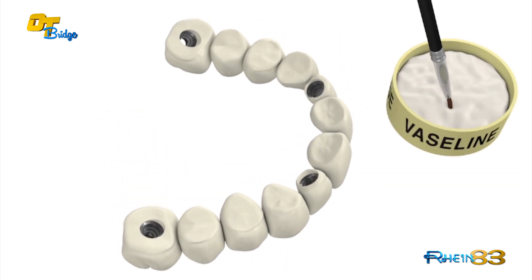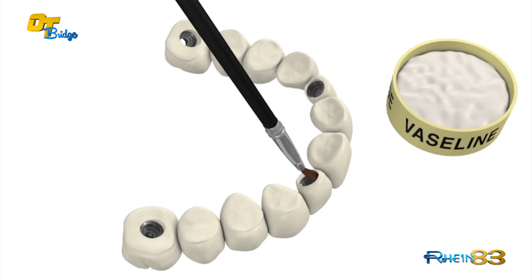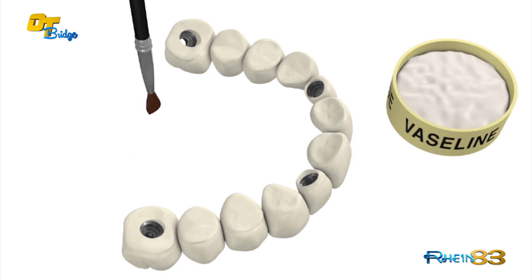The provisional pink sega ring will be removed and replaced with the white sega ring, inserting it into the abutments base. The open part of the ring must be rotated into the maximum undercut position.